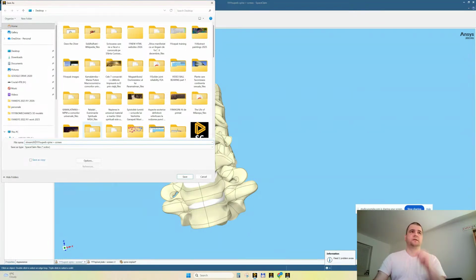Stream 28, superb spine plus screws. And we will also insert the cage, the fusion cage. It's kind of a mouthful, but let's quit the superb or whatever, because whatever we do is superb after all.